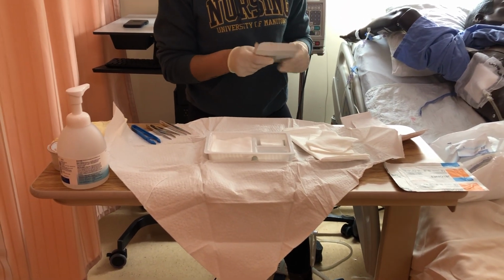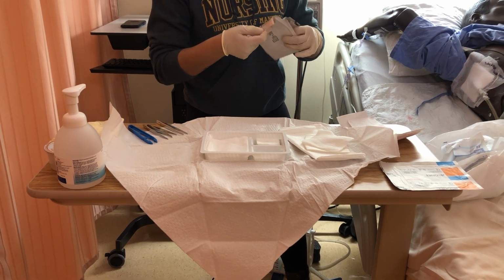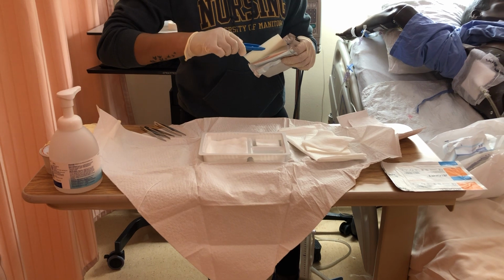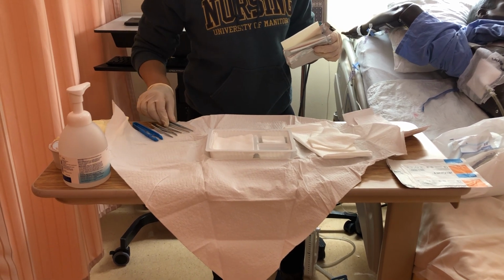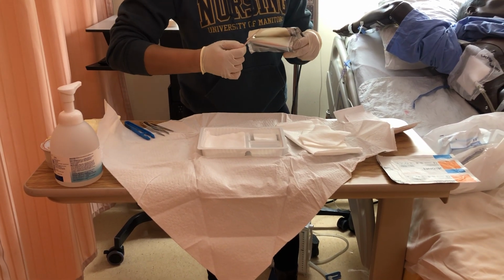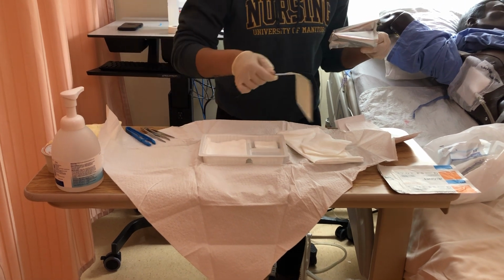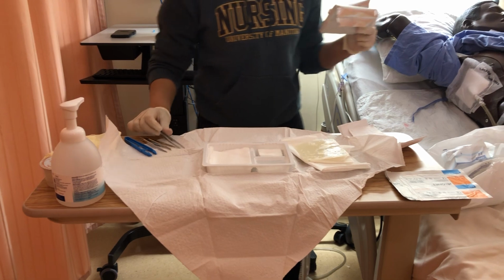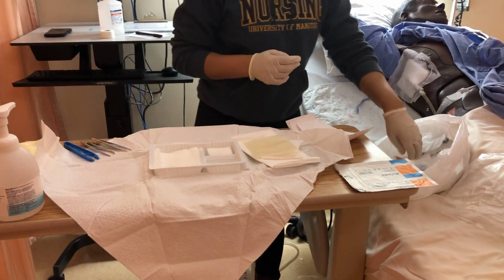Okay, so I'm going to start now with the dressing. It's a little slippery. Let's try this. Just put my garbage here. I'm just gonna put this on the side for now. It's good enough. Okay. It's all garbage.